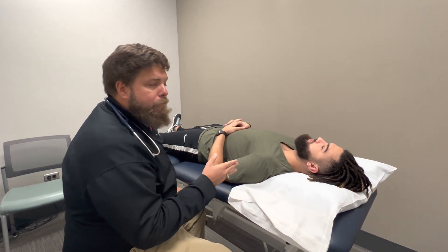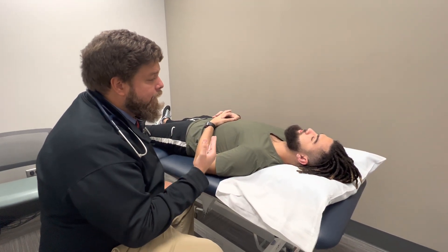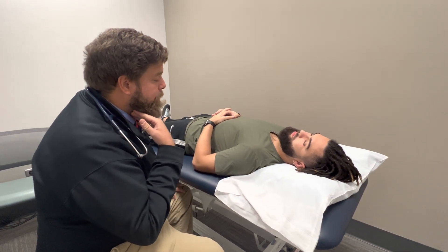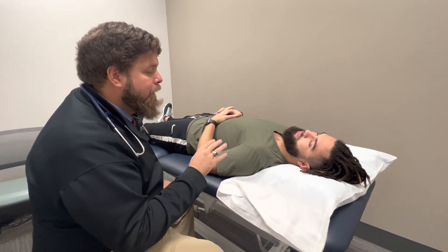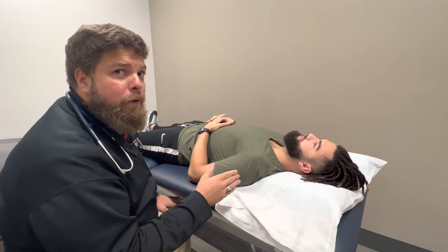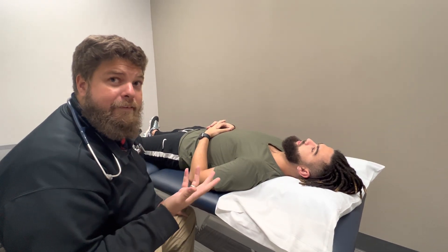So Josh, before we get started, I'm just going to go over what we're going to be doing here. I'm going to be listening to the sounds of the arteries through your neck. I'm going to be palpating along your neck. Are you okay and comfortable with that? Sounds good. Always important to make sure that we're explaining what you're going to be doing to the patient, especially when feeling in the neck. It's a very sensitive area.